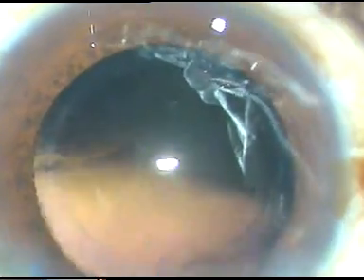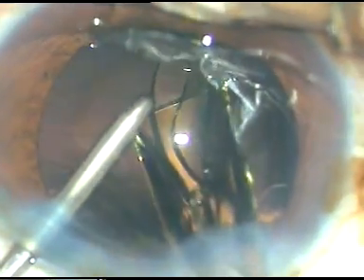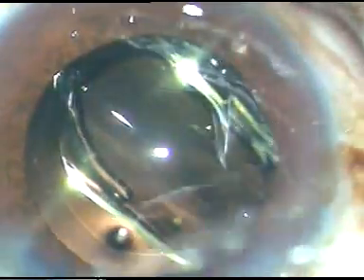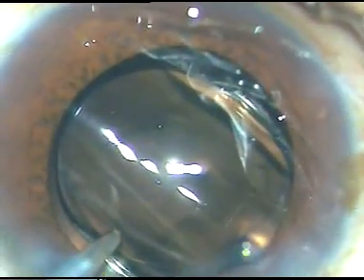Now the lens is injected into the anterior chamber. The leading haptic — I am not sure whether it is going into the capsular bag or not. I depress the upper part of the lens and send the trailing haptic into the capsular bag. Now let me check if the leading haptic is in the capsular bag or not.